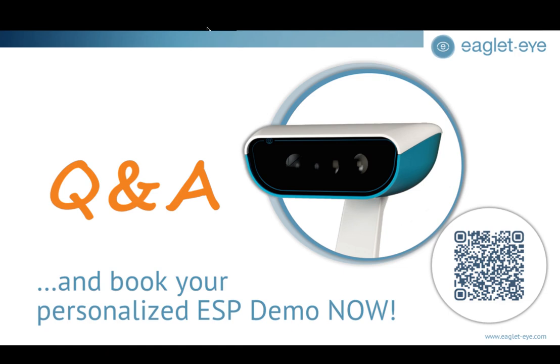Okay. Yeah, because a lot of people initially get a little confused because we're using height data as opposed to curvature data, and they're making that conversion from using a topographer every day to the ESP. Yes. Okay. ESP is elevation driven, and so you really just have to think about what that physical structure is. It's almost like a geographical map in your mind. It's just a little bit of a different way of thinking about the data.